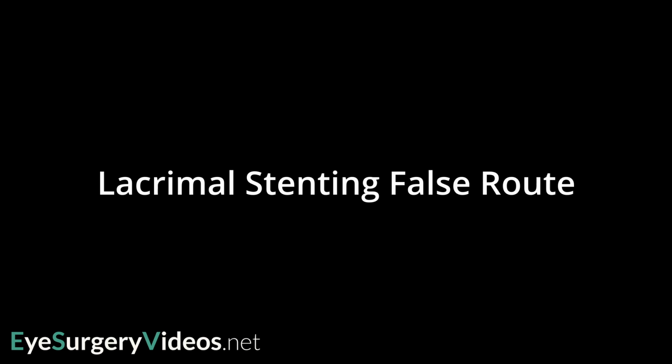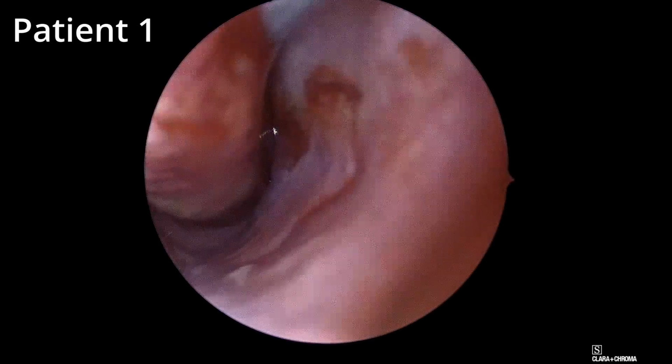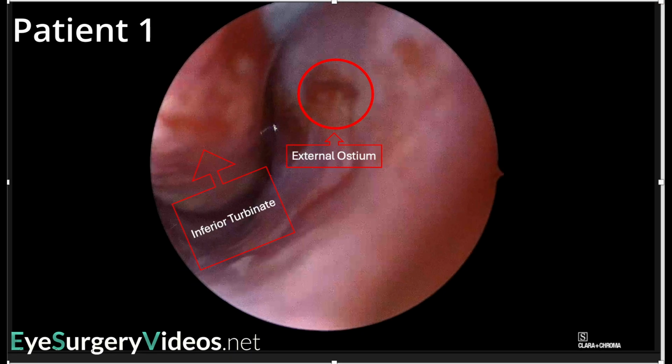In this video, we present two cases of false passage formation in nasolacrimal duct stenting, highlighting the benefit of nasal endoscopic visualization. The natural external ostium can be seen under the inferior turbinate.